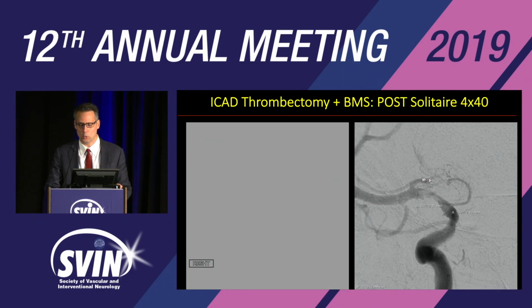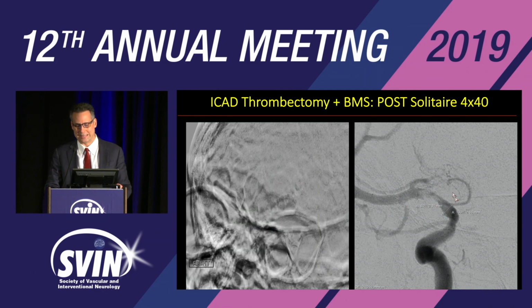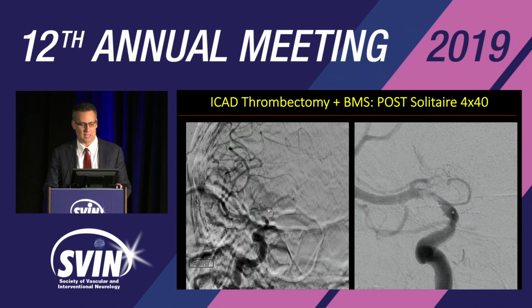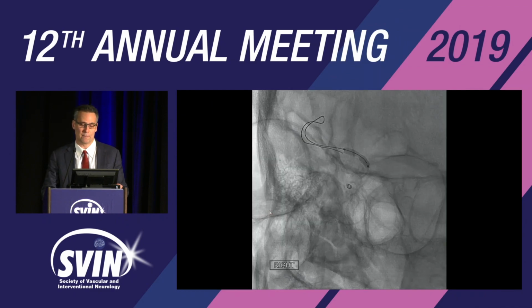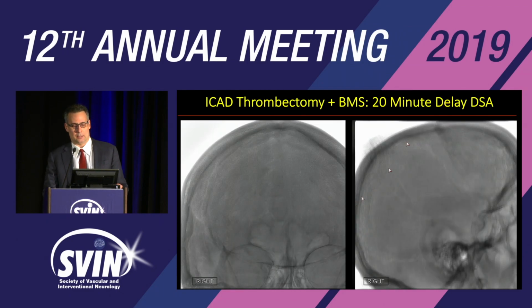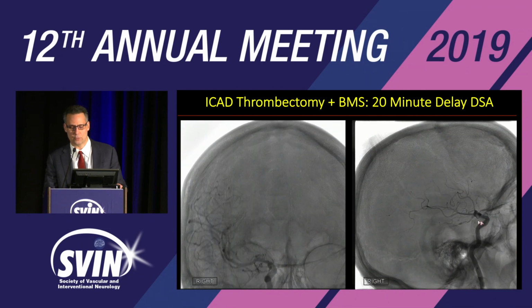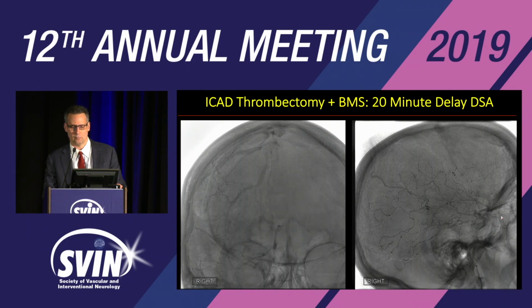So here is post stent retriever. Okay. So an ugly plaque, and then unfortunately I loaded the patient with 5,000 units of heparin before doing this. Beautiful result. NIH went from 14 to 0, actually 1. She had a visual field cut. And here is the 20-minute delay, showing essentially a TICI 3 normal angiogram. You see, pretty normal.